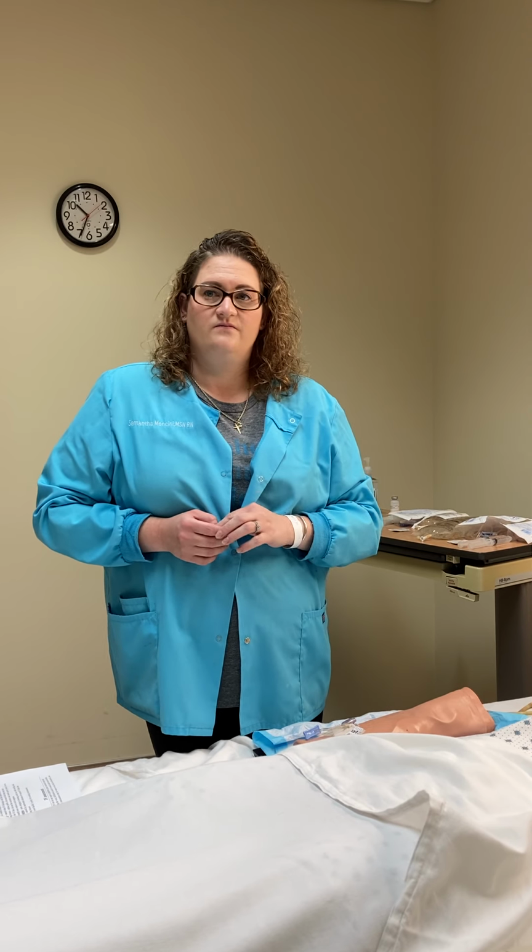So for this video, we're going to review a little bit about the purpose of using IV therapy with our patients, some of the complications we might come across when we are assessing a peripheral IV, which is inserted in the arms, a few different types of IV solutions.